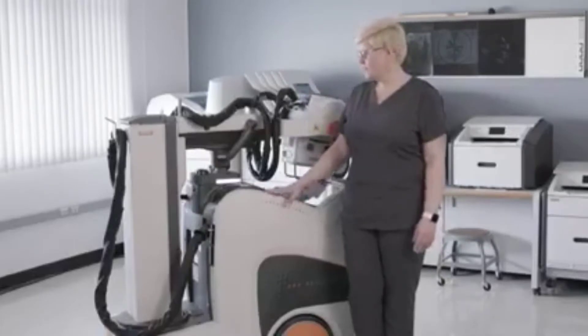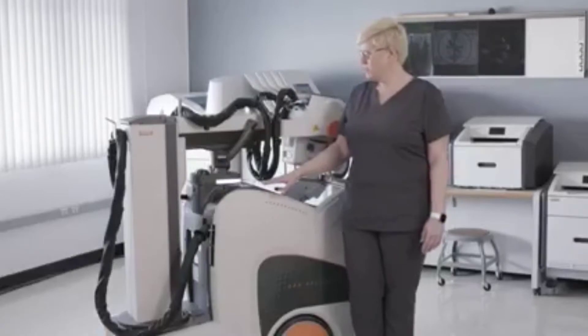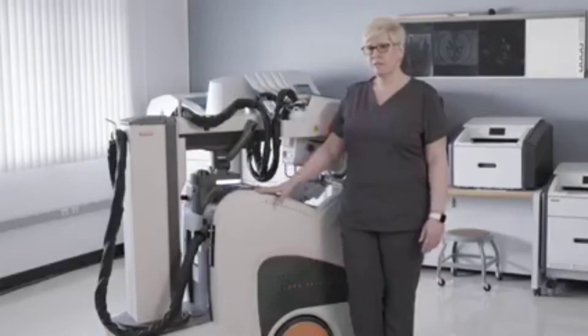CareStream launched the Revolution system several years ago. It has been the number one selling mobile system in the market and it was the first mobile system to have a collapsible column.